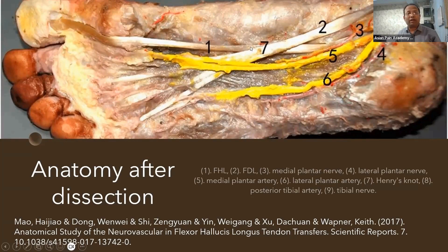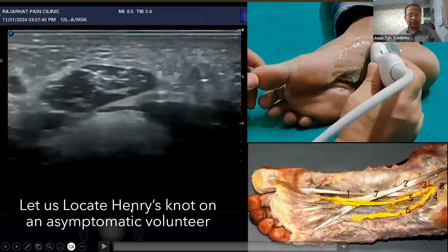So what is the Master Knot of Henry? It is the area where two tendons — flexor hallucis longus and flexor digitorum longus — overlap. That area is called the Knot of Henry. Let us locate the Henry's Knot on an asymptomatic volunteer.